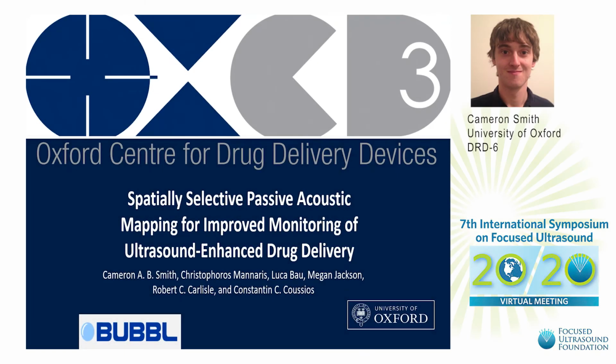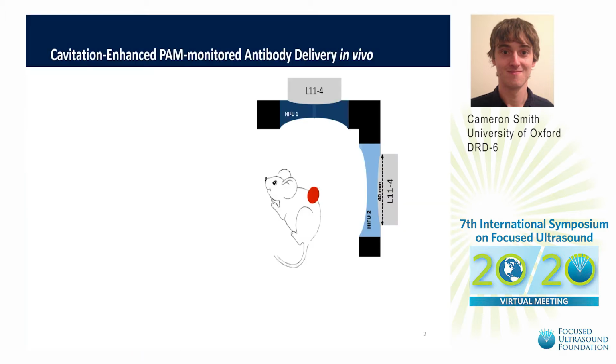Hello, I'm Cameron Smith, and today I'll be presenting my work on spatially selective passive acoustic mapping for improved monitoring of ultrasound-enhanced drug delivery. The aim of the work was to try and see if passive acoustic mapping could be used to monitor the efficacy of cavitation-enhanced antibody delivery in an in vivo setting.